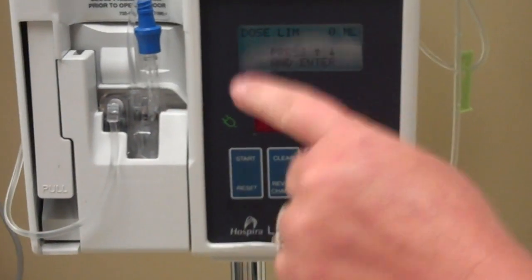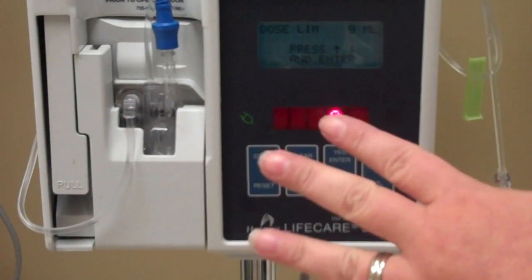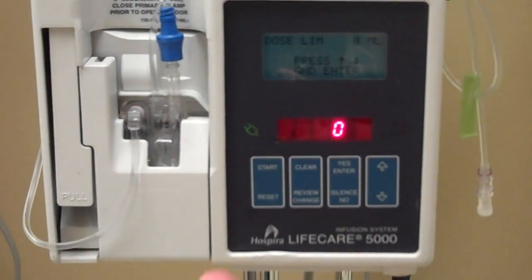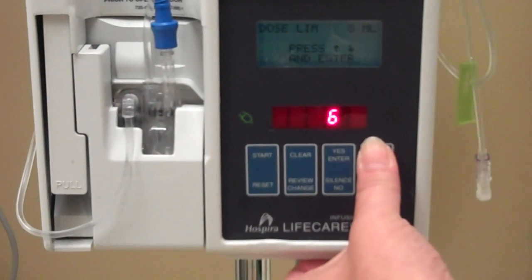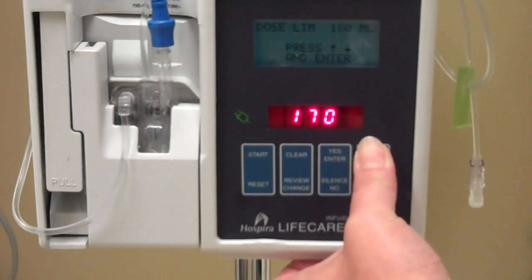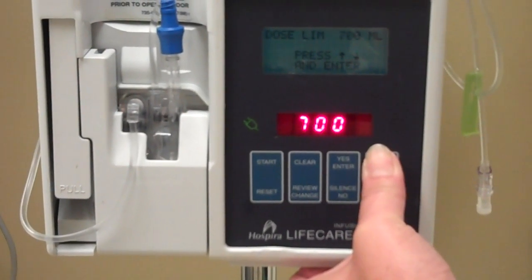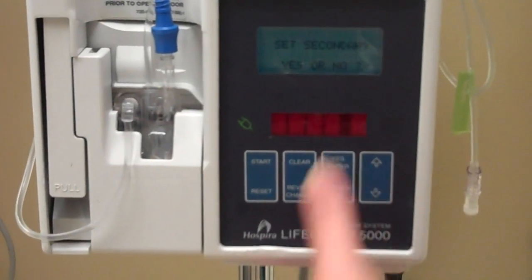Then it says dose limit. Dose limit means how much is in the bag — what's the limit of the volume you want to set the pump for? Just like the Alaris, I'm going to set it for 900, because that's when the pump is going to beep and let me know it's about to be finished. So if I have a bag with 1000 cc's and I set it for 900, at 900 it's going to beep, so the tubing won't run dry before I have a chance to get another bag. 900 and enter.